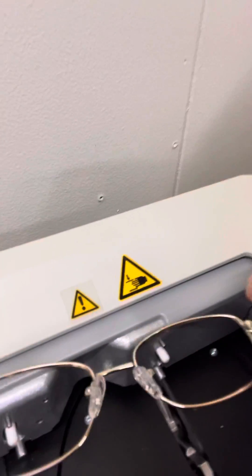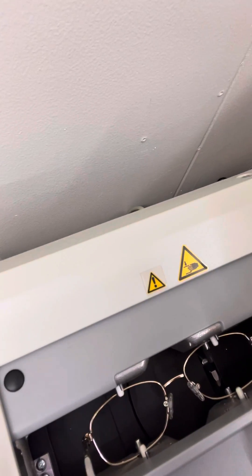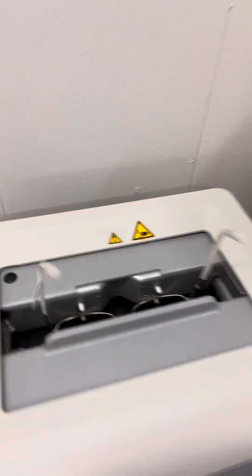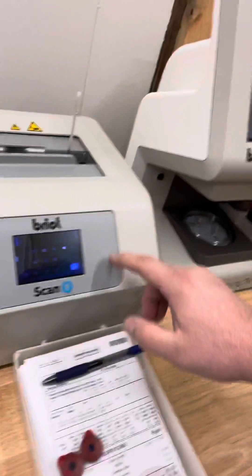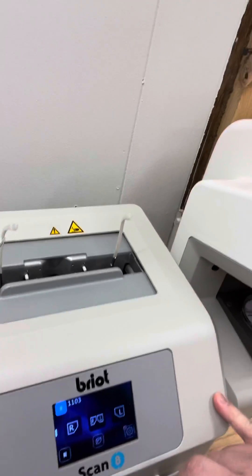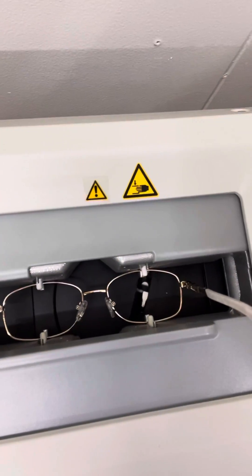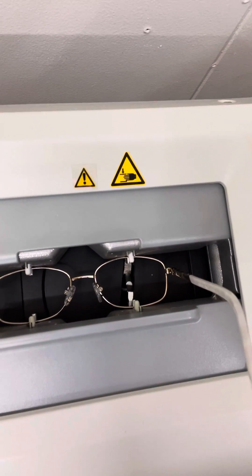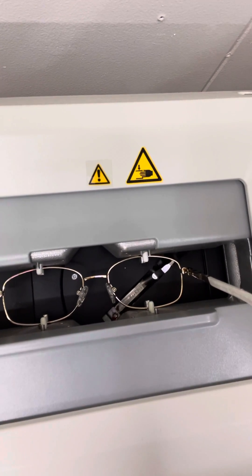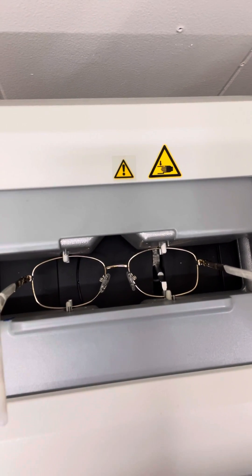I'm going to open up our frame and put it right in there like that and it will hold it. I hit this, we put in our tray number — this is 1103 — and we want to do both. So here we go!